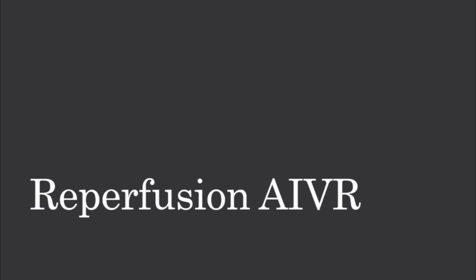Hello everybody, my name is Matt, I'm with Scope Education, and here we're going to be talking about Reperfusion AIVR.